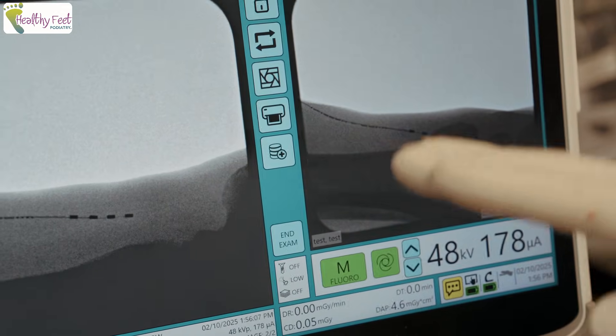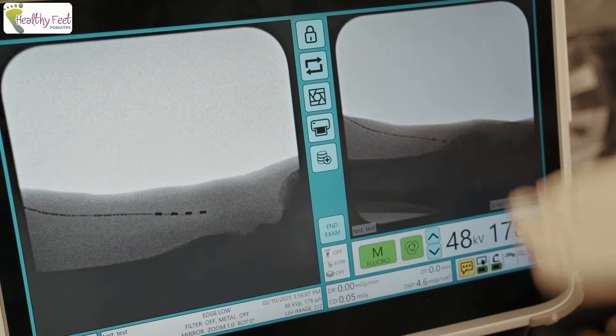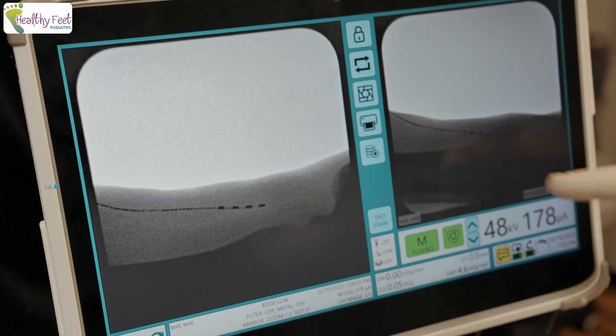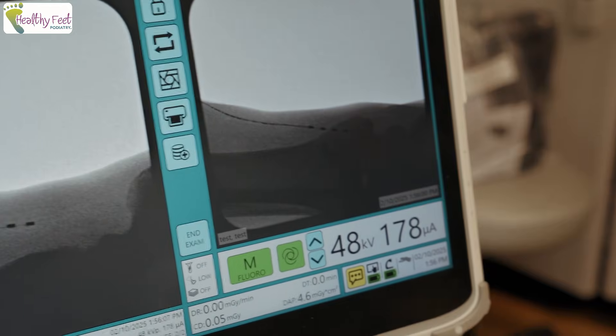You're verifying on two different views. You don't have to be on the nerve itself — you just want to be within about six millimeters of where the nerve runs.